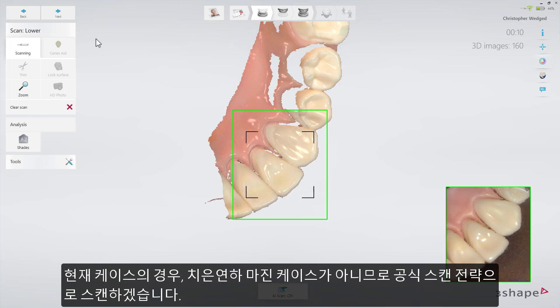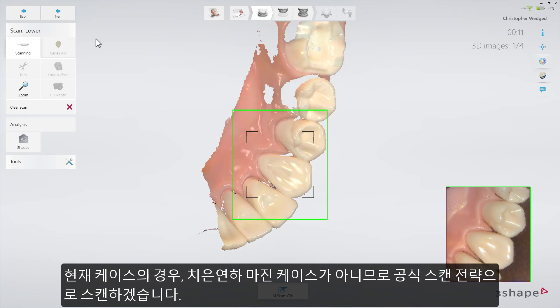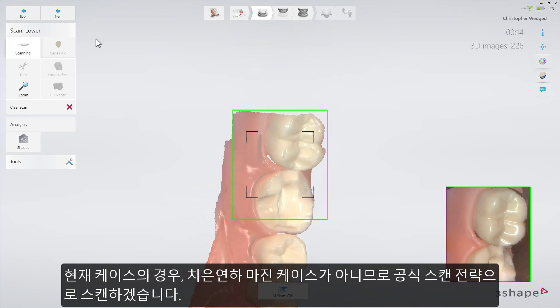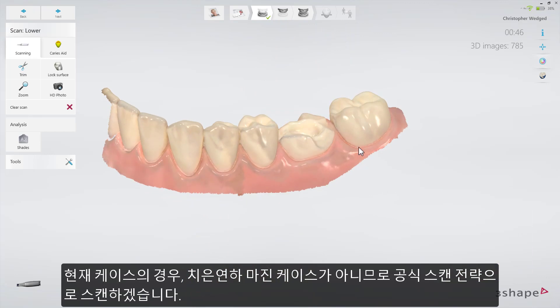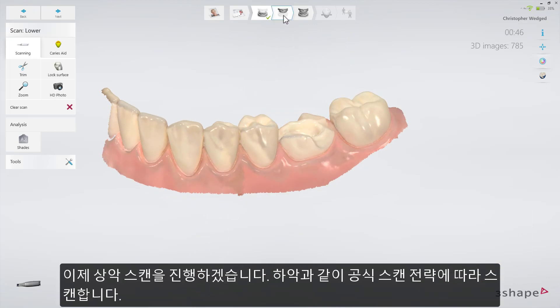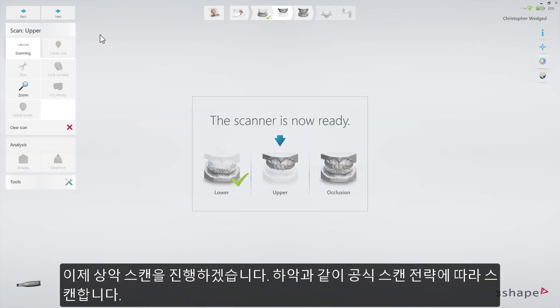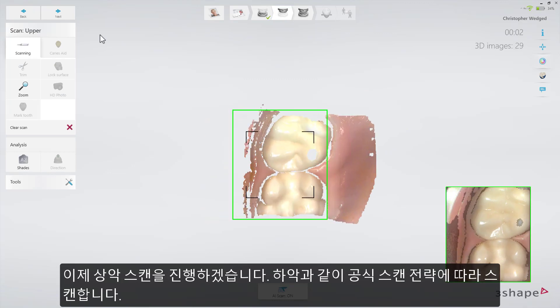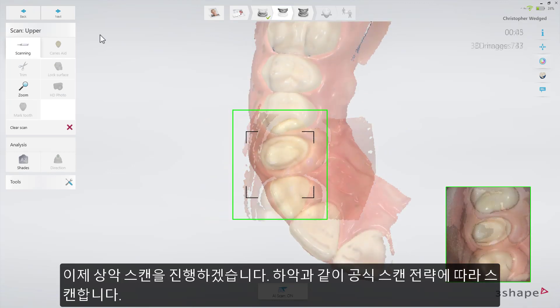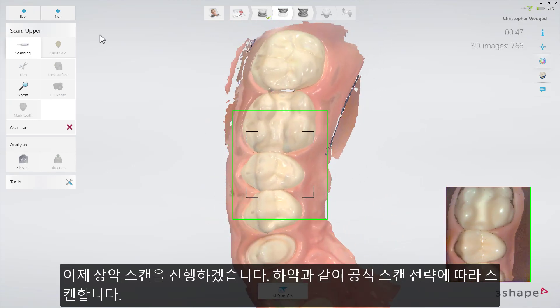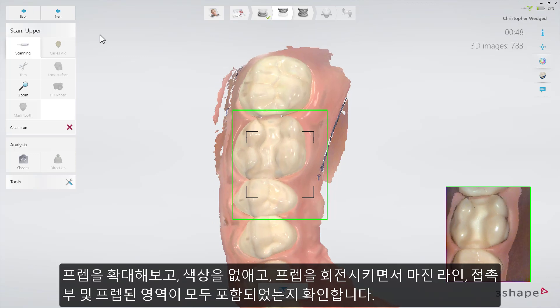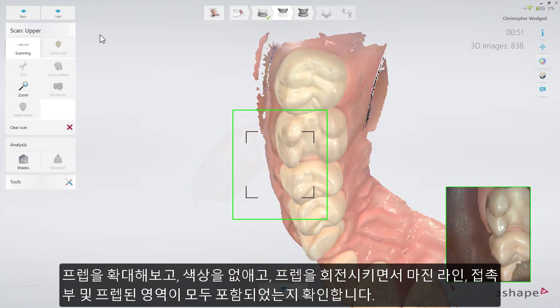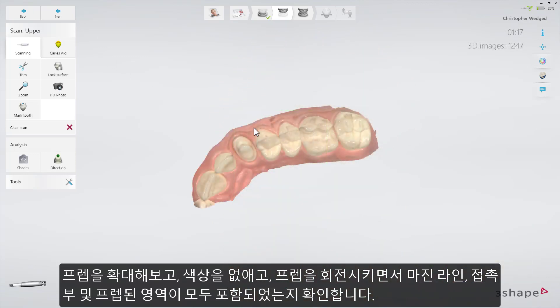In this particular case, there are no parts of the margin below the gingiva, so simply follow the official scan strategy. Now proceed to the upper arch. Scan the same area as in the lower arch, following the official scan strategy. Make sure that you cover the prepped area, including the margin line and contact points.